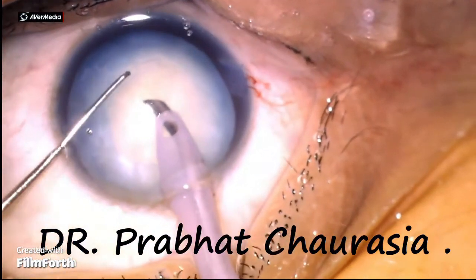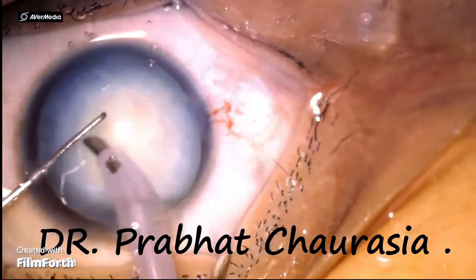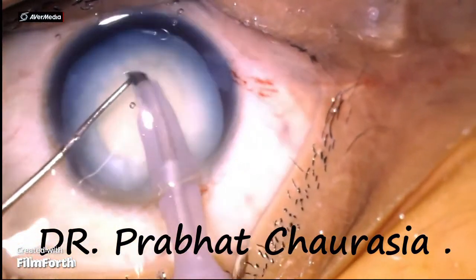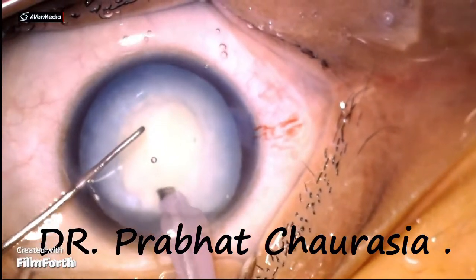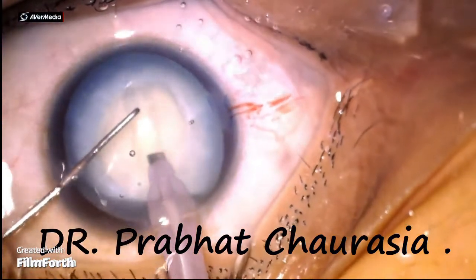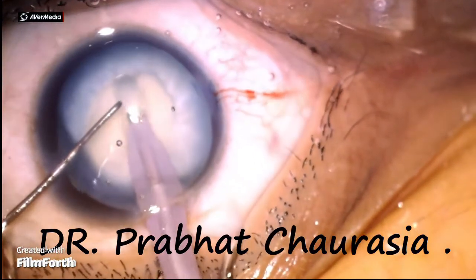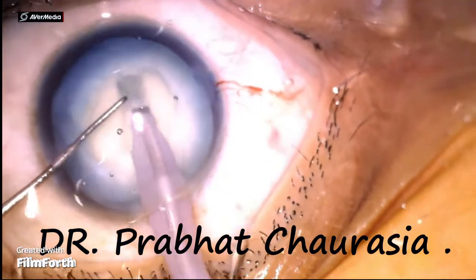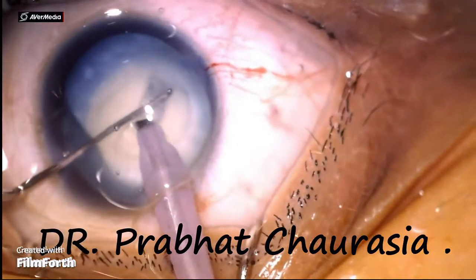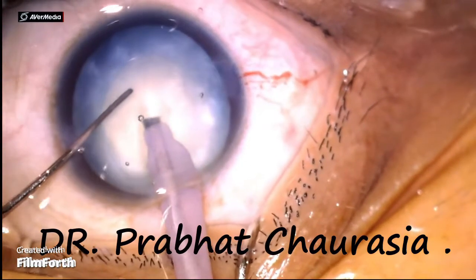Emulsify some superficial cortex in US1 mode and then make a trench. This is again a modified direct chop technique, in which first I am making a trench of sufficient depth, and then rotate the nucleus about 180 degrees. Now go to US2 mode — hold the nucleus with the help of vacuum, embed the phaco tip, and again divide the nucleus into hemi-nuclei.